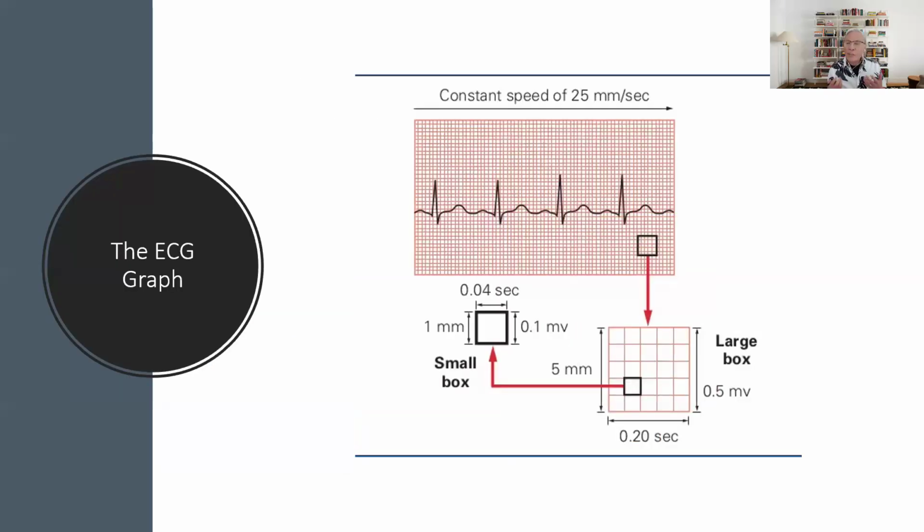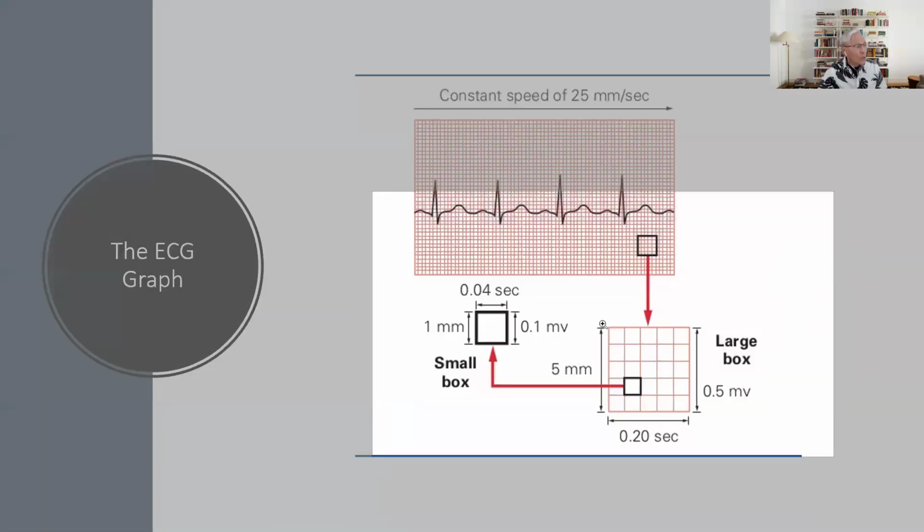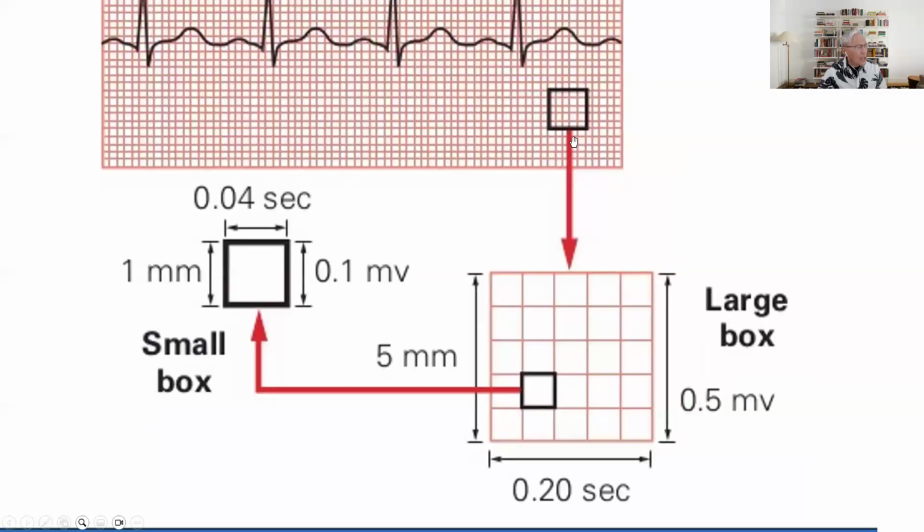Whenever we're looking at an electrocardiogram, it is a graph. And like any graph, we need to understand it in order to be able to interpret any waveforms that are going to be inscribed on it. So here is an enlarged view of this particular segment right over here. In order to interpret electrocardiograms, we're going to examine the timing of these waveforms.